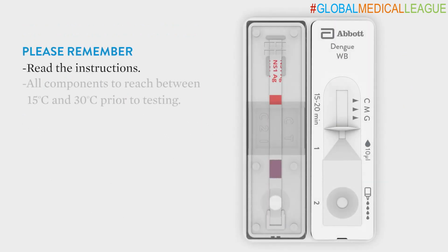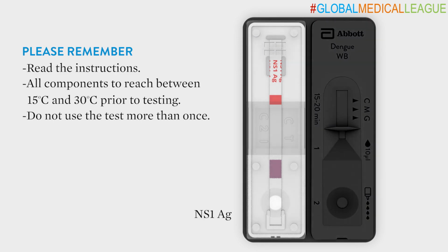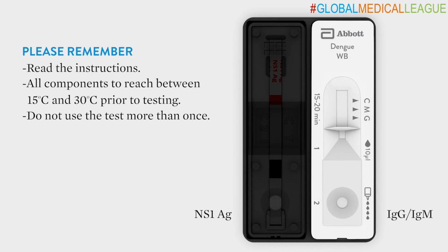Here are some important notes before you begin. There are two devices which allow you to detect both dengue virus NS1 antigen and IgG/IgM antibodies.